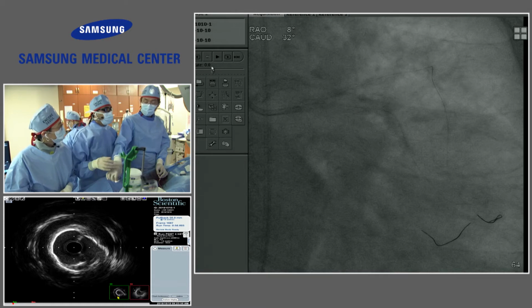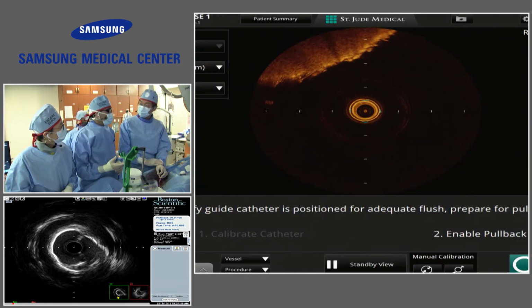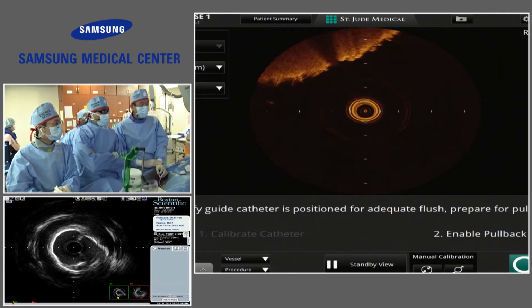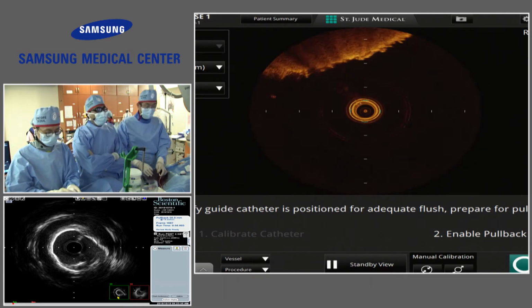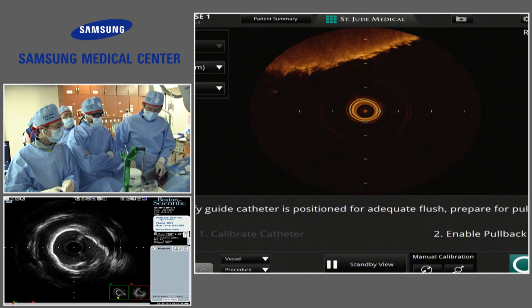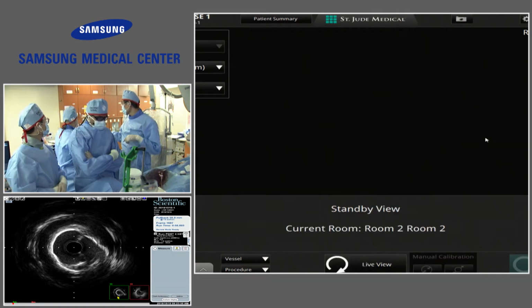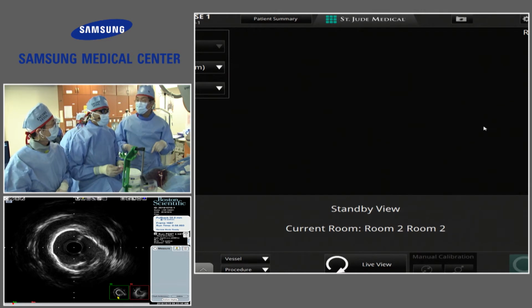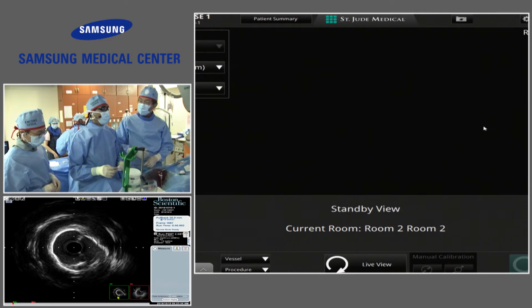So the OCT, rotablation first. Why? Well, if we're going to rotablate, we have to pull the wire. Can we take a poll from the audience and from the panel? We'll do what you say. Let me try to run a through wire to the circumflex with the wire and stay. I could try another wire.